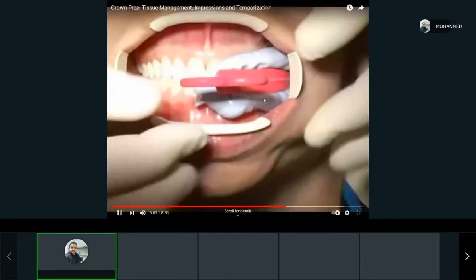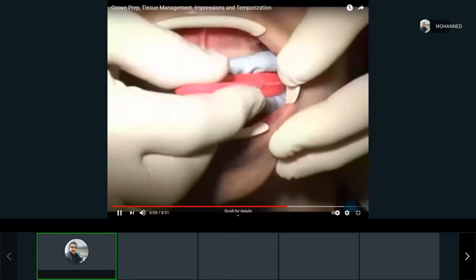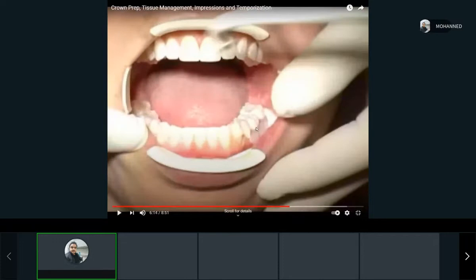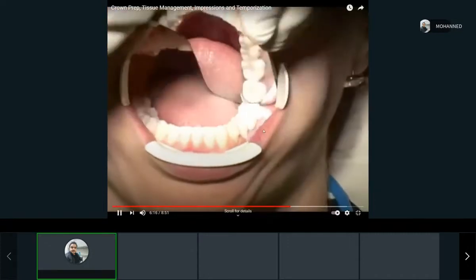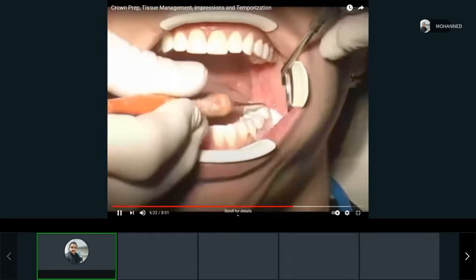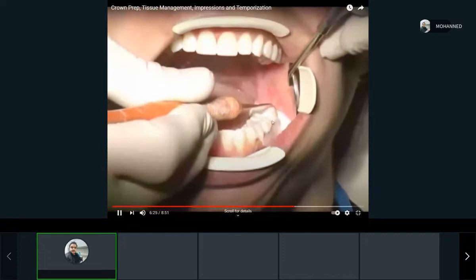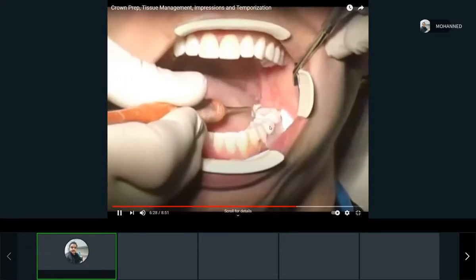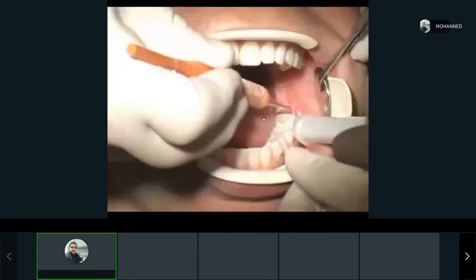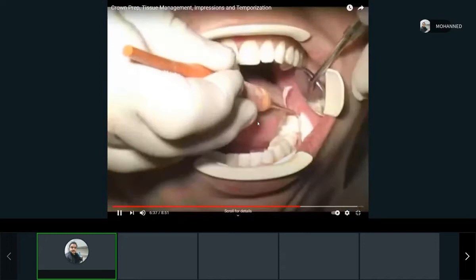And then make the patient bite on it because it fits on their teeth like a glove, right? And now you see they have their teeth back. But these are temporary teeth. You'll see they remove them. They're going to clean the temporary stuff out of it. See how they look nice like the actual original teeth before preparing them, right? They're just going to clean up that extra. Boom. Remove. Clean up.